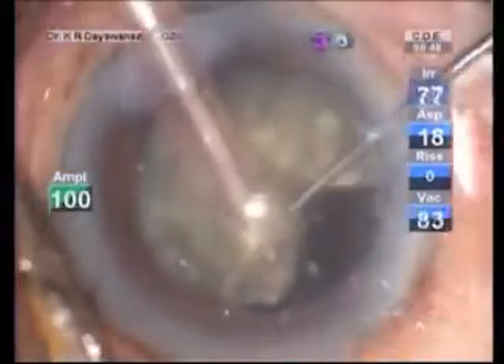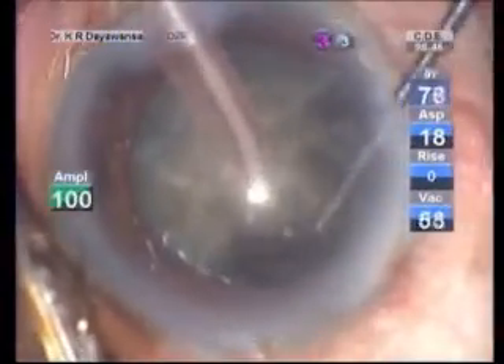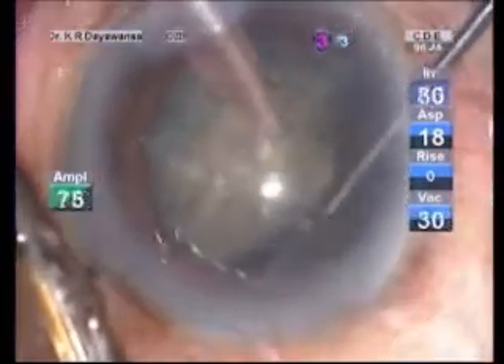Adequate size of capsulorhexis and careful hydrodissection with good endothelial coating are other basic steps vital for the success.